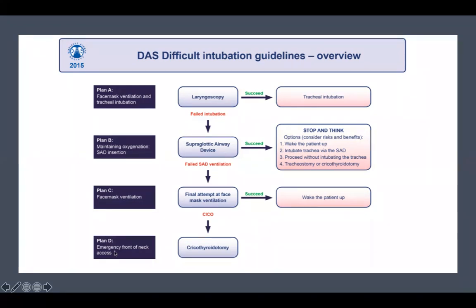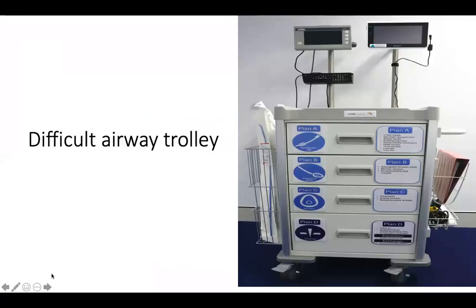So you can actually organize your trolley like this in your hospital to have a plan A, plan B, plan C, and a plan D. That will help you and guide you in the process of managing the patient's airway.